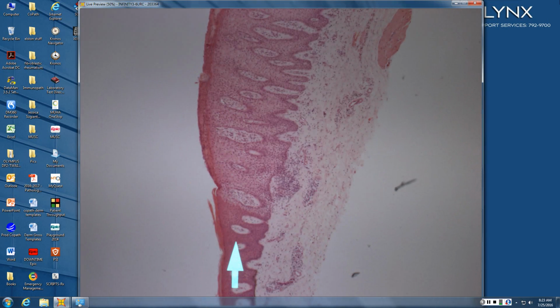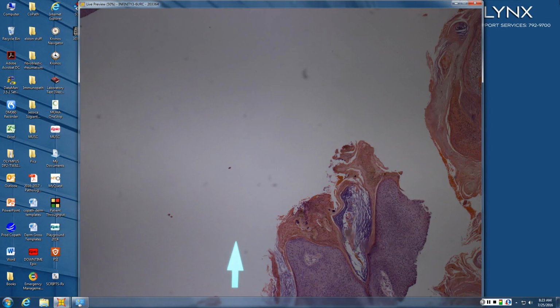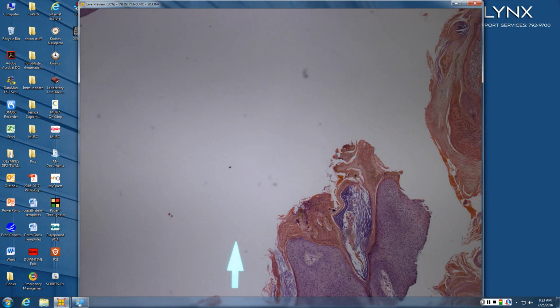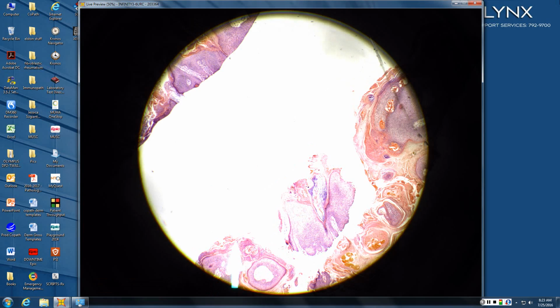Whereas this one, there you go. Looks like clear cell acanthoma. Correct. Yeah, I thought you were reinforcing a point or something. Sorry. The point is, look at the slide, don't listen to me. There may be lots of red herrings, things that take you in the wrong direction. The answer's on the slide.